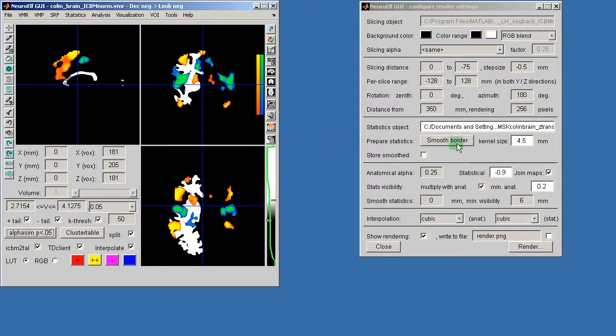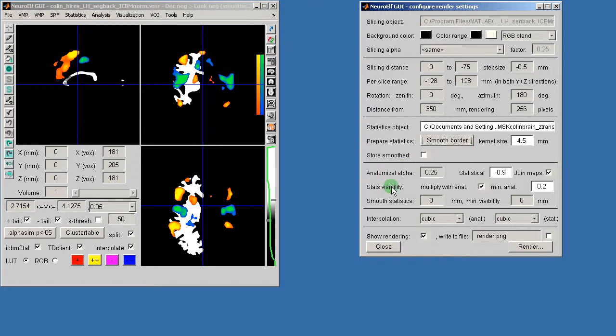And now I will start the rendering. And I begin in a very low resolution because this doesn't take as much time.